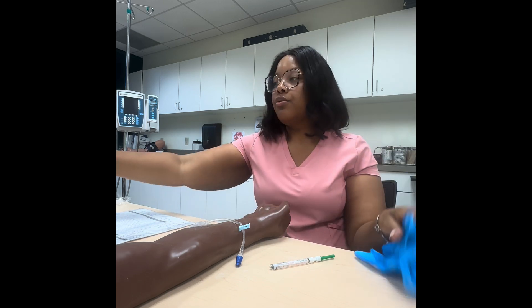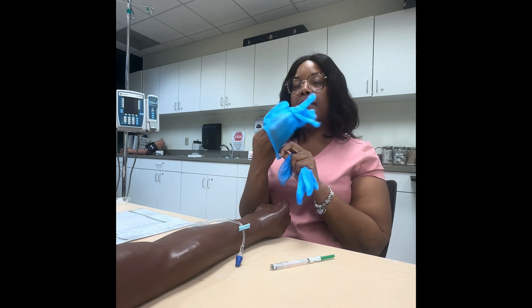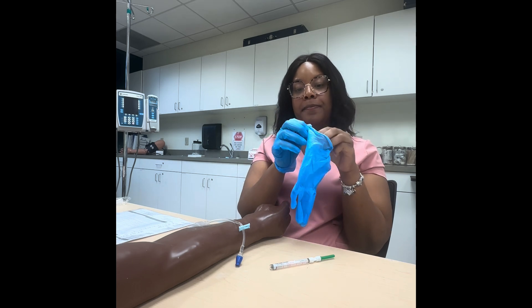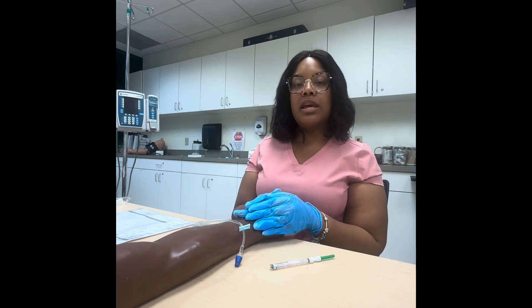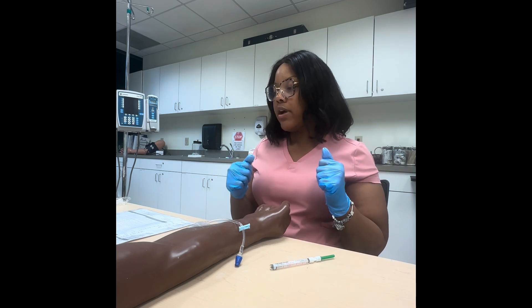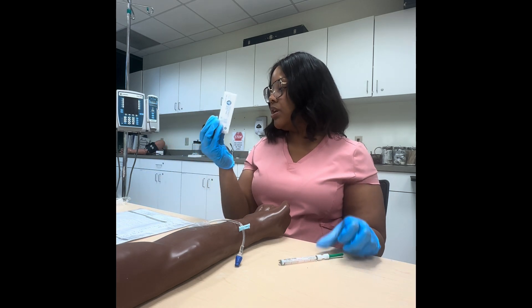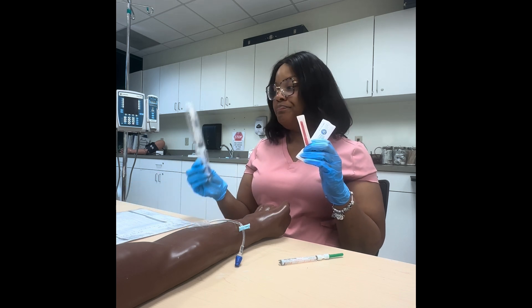We've got our correct medications, so perform hand hygiene and put on your gloves. Go back and verify your patient — Miss Smith, can you tell us your name and date of birth? After confirming her name and date of birth, always ask about allergies. We also double-check the chart for any documented allergies. You'll need the medication, a syringe, a blunt tip needle, and a flush.